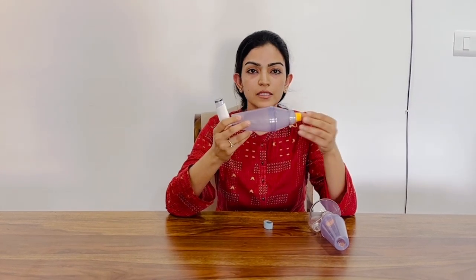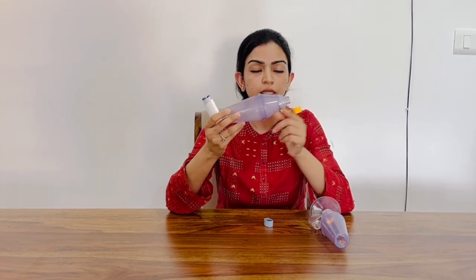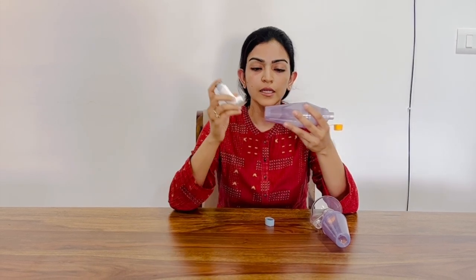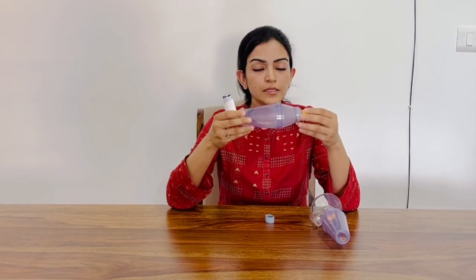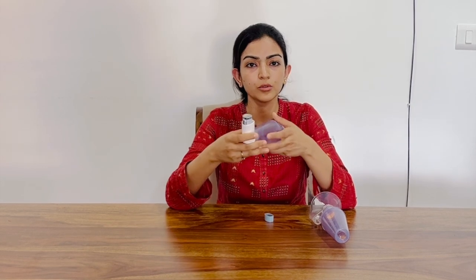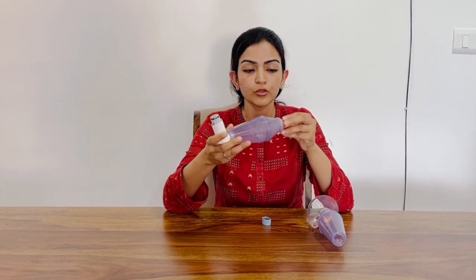And when the child is breathing, you should be able to hear the clicking sound of the valve opening and closing. If 2 puffs have been recommended, again you have to remove the spacer, shake the inhaler well, and then repeat the same steps as before. This is how the 2 puffs have to be taken. If the child is older and can do a breath hold, it is advisable to inhale the medicine and hold for up to a count of 10 seconds. That ensures better delivery into the lungs.